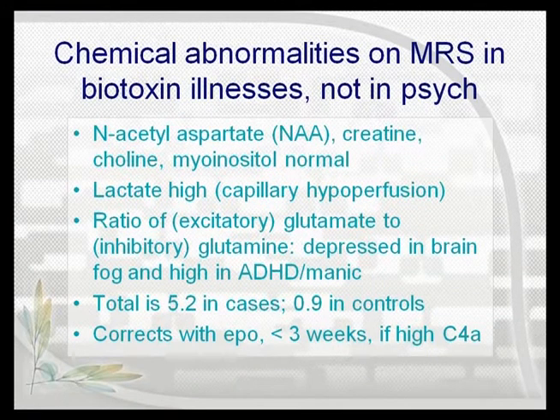N-acetyl aspartate tells you about white matter. Choline tells you about acetylcholine, the main neurotransmitter in the brain. Myoinositol tells you about glial cell elements. Lactate tells you about capillary hypoperfusion. Glutamate to glutamine is suppressed in most of your patients. You'll see the manic people, the ADD people, you'll see that elevated glutamate-glutamine ratio.